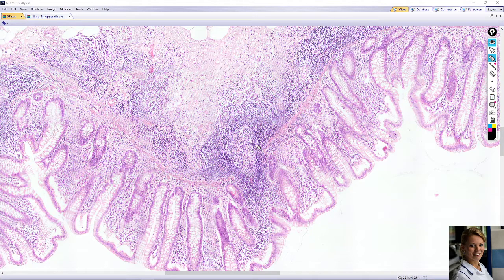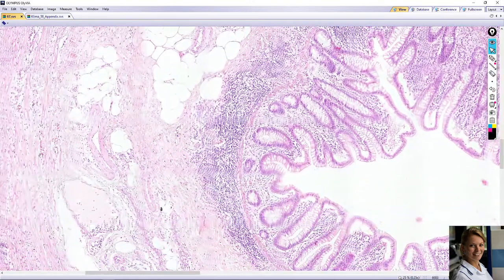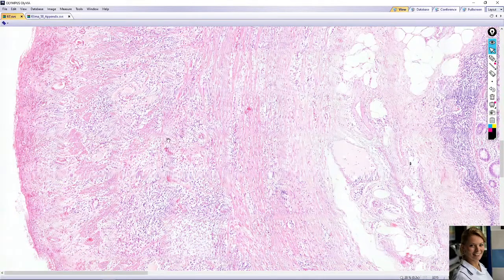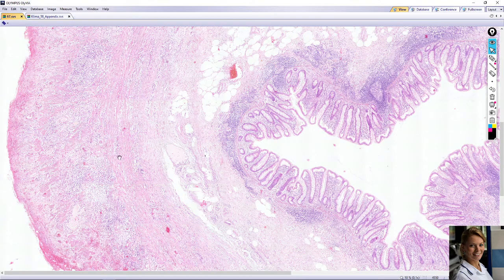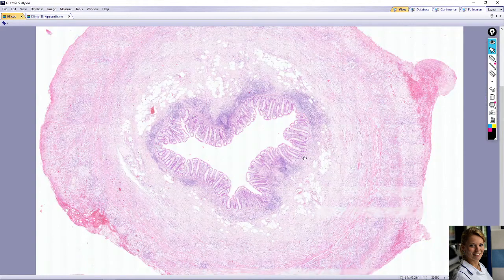But in this slide, the muscularis externa, especially the longitudinal layer. This is submucosa, circular, but especially the longitudinal layer also contains lymphocytes, and the arrangement of this layer is not visible, so it's not physiological but pathophysiological. So there is a lot of lymphoid tissue in mucosa and submucosa.